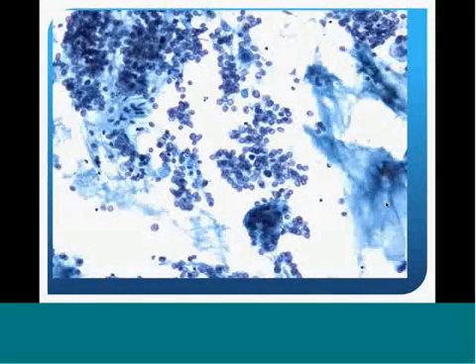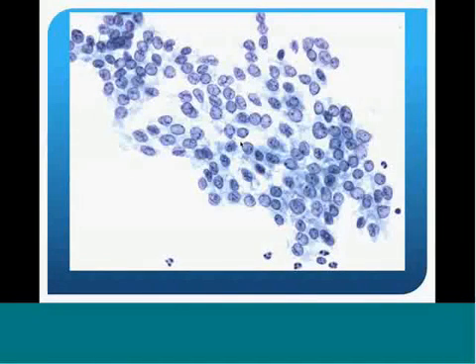They are enlarged. You can even see some grooves in the nuclei, even though this is a very low power view. But for the most part, these nuclei are very optically clear. You can almost see through them. And this is more evident on higher power, where you can see the grooves here. Well, many of them have grooves.